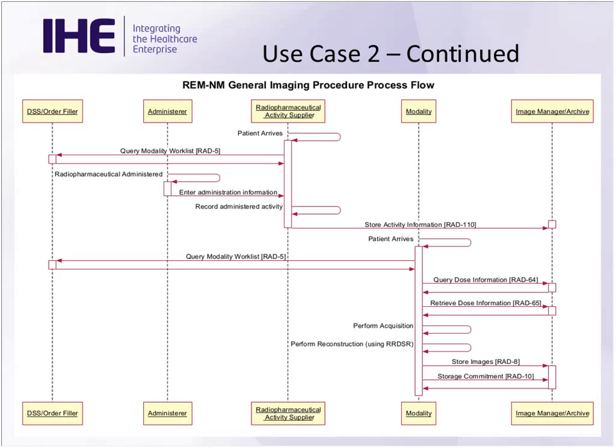It's all electronic, and this closes a number of errors that were potential and also happen quite frequently in departments, where the activity information wasn't correctly entered at the scanner, or there were time differences between one room where they were doing the injection and what the modality thought the time was. So there have been papers published in nuclear medicine about these types of errors and how they affect the quality of the studies.